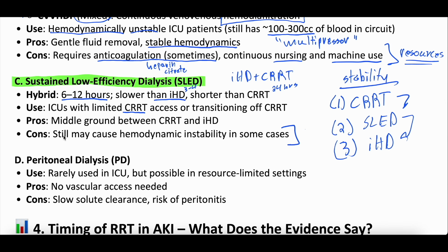And then we just want to do a shout out to peritoneal dialysis. For those of you that don't know what this is, it's actually really interesting. The patients have a catheter that goes from the outside world into their belly. We're terrible at drawing. Let's see if we can. Here will be someone's belly. Here's their legs down there. Their head is up here somewhere. Yay, human. This is their chest. Here's their belly button. They have a catheter that sits in their belly, right? It's going actually in their belly, and it stays there.